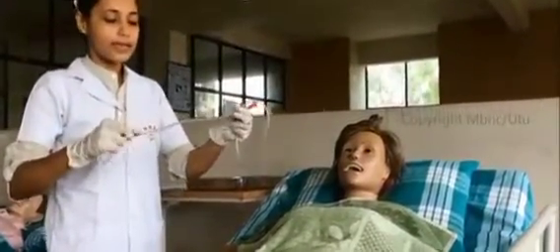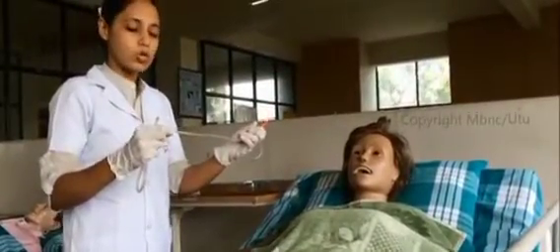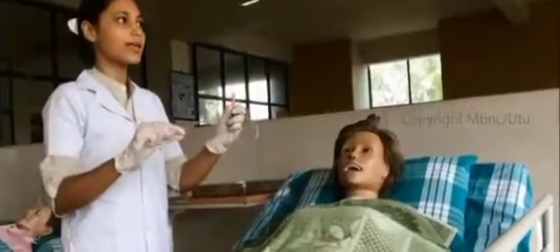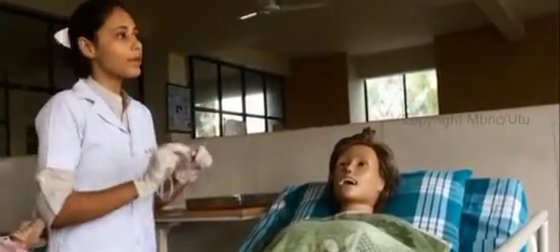Here on the body of the NG tube, the markings will be there. It will start from 50, 60 and 70. In some of the NG tubes, the 40 centimeter mark will also be there. This 40 centimeter from the tip will indicate that when we are inserting, it will go to the cardiac sphincter. The 50 centimeter will show that the Ryle's tube is in the stomach. The 60 centimeter will show it is in the pylorus part, and the 70 centimeter from the tip will indicate that it will go into the duodenum.